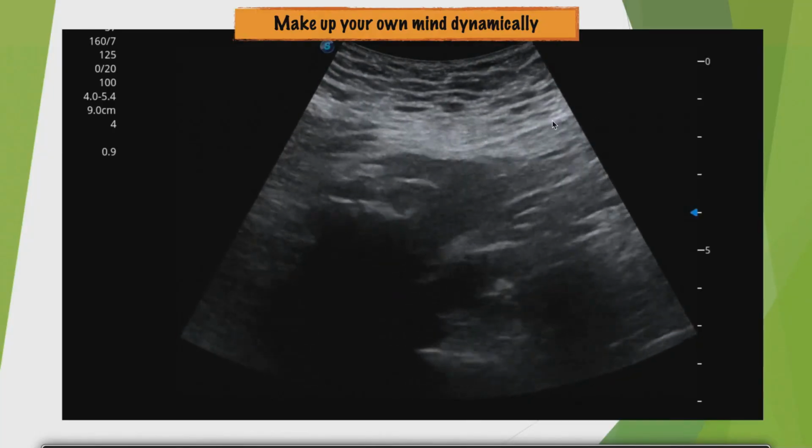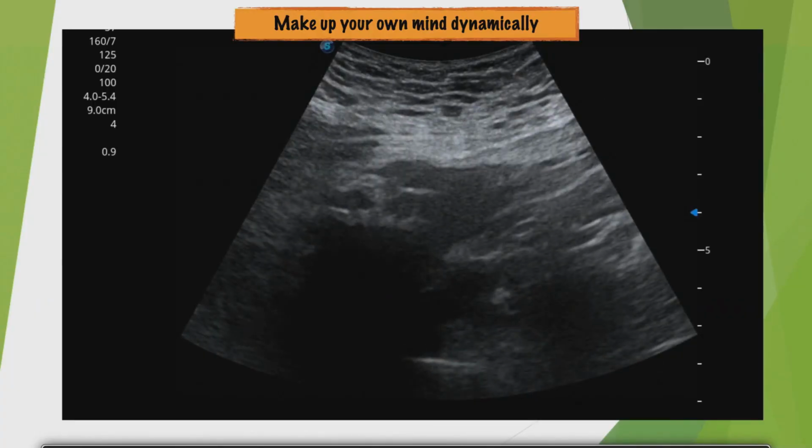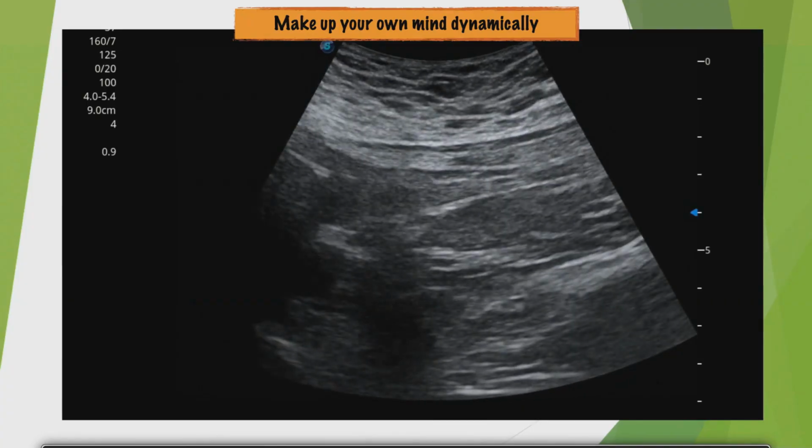Proximal tendon. I was able to go a little further to see the rest of my tendon by aligning the fibers a little more. Here we can see very clearly our conjoined tendon with its fibrillar aspect, and here we can see the interruption of this aspect. Yet the fibers don't change direction.